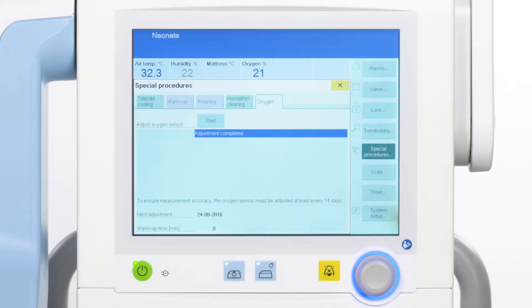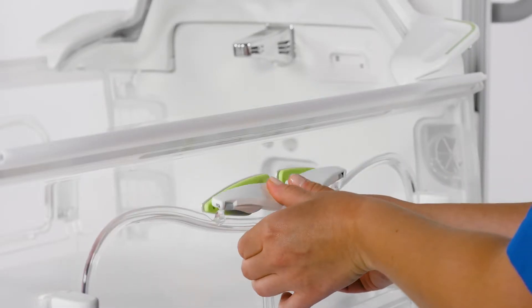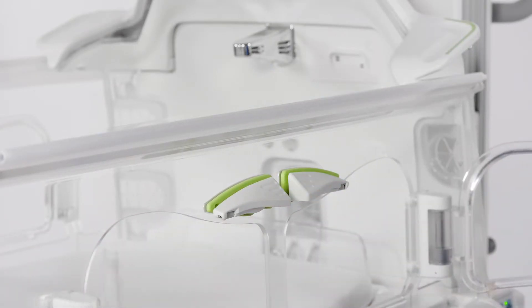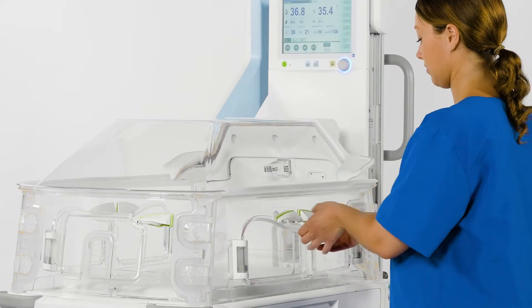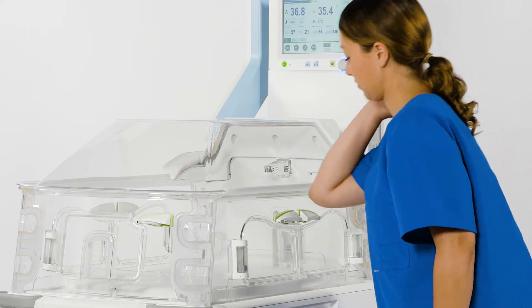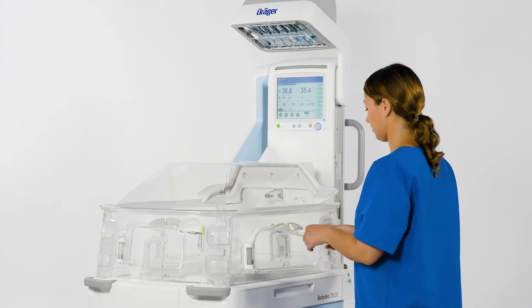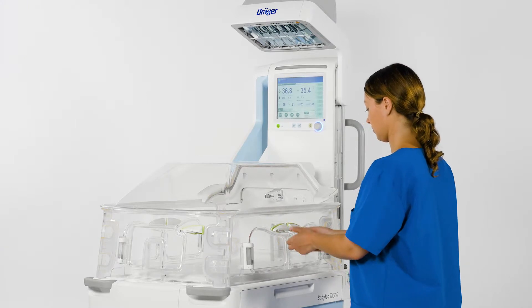Now let's take a look at how to operate Baby Leo. In incubator operation, the best access to the patient is via the hand ports. The centrally positioned locks on the hand ports are also used for opening and closing. Using your hands or elbows, push down the ridged part of the lock. Both parts can be simultaneously opened with a single hand or elbow.